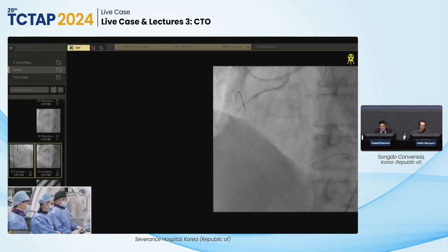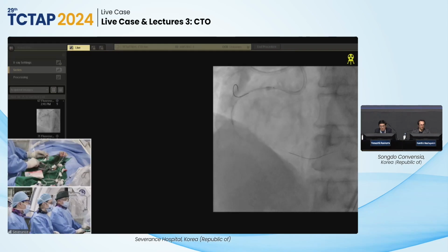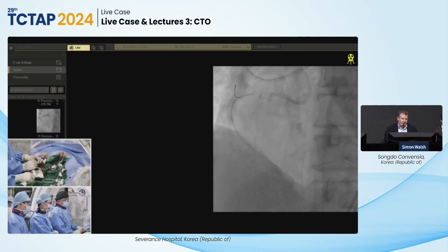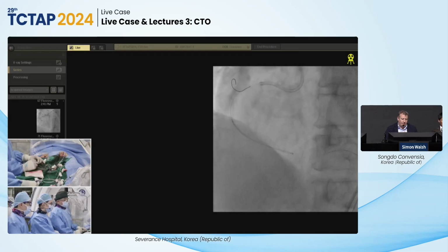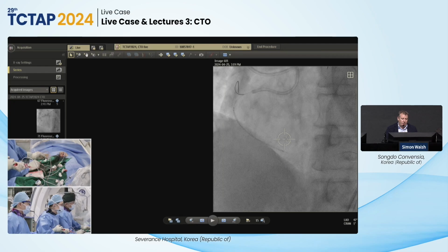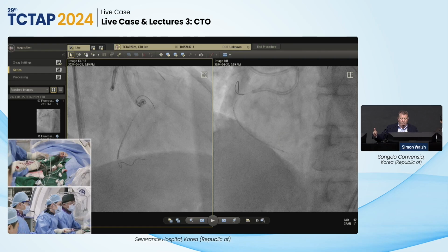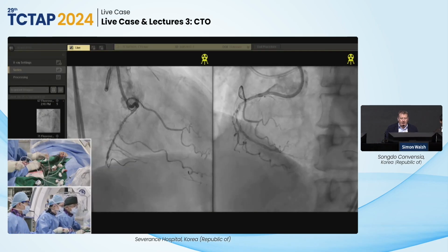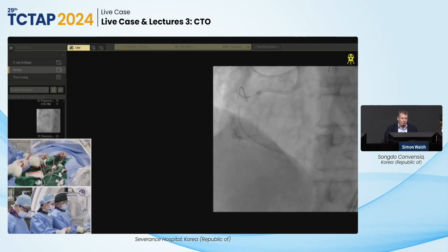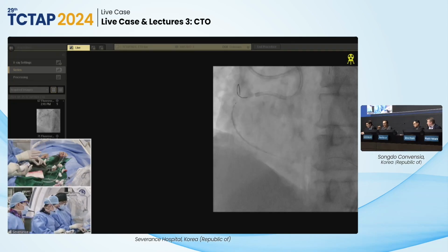What do you think the size of the stent should be? I think the stent diameter should be predicted by your landing zone diameter, and you want to match the diameter of the stent to whatever it is distally, and then you can always post-dilate the proximal part into a bigger diameter with your NC balloon. So it's nice whenever you find your landing zone with IVUS to actually take a little puff and a fluoroscopic store, and then you can use that as a reference image to site the distal edge of the stent in an area hopefully where there's a small or minimal plaque burden, and then you can post-dilate according to what the proximal vessel looks like. Well, I think you should be able to put a 3.0 and then probably post-dilate.